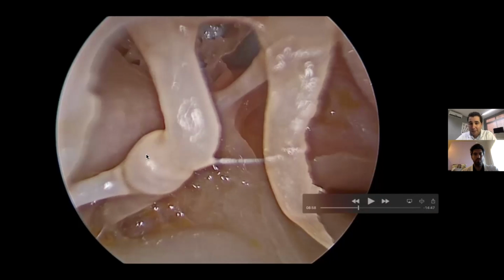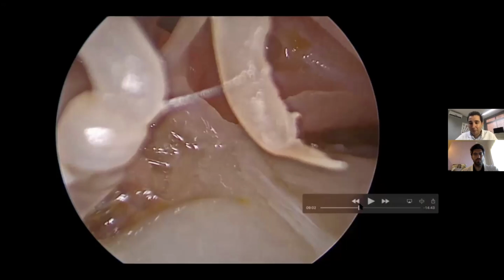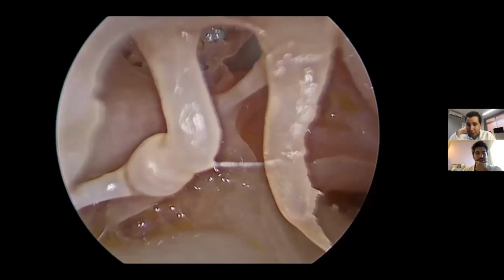Of course, to find the facial nerve I try to use the oval window niche, because if you don't have malformations, it's going to be more reliable. So, the cochleariform process again, and one very important structure here that I didn't talk about. The cochleariform process is a very nice anatomical landmark for three things. First one is the ganglion, which is a little bit above and anterior to the cochleariform process. Second one, below it, is the Jacobson nerve that I had talked about.